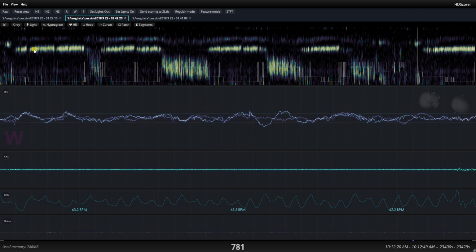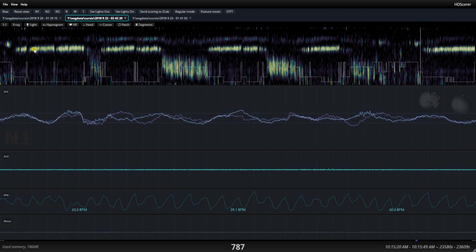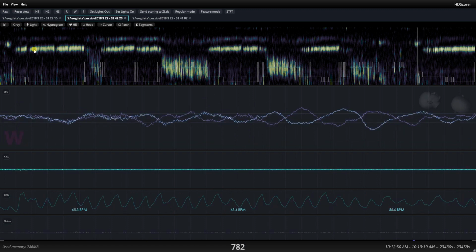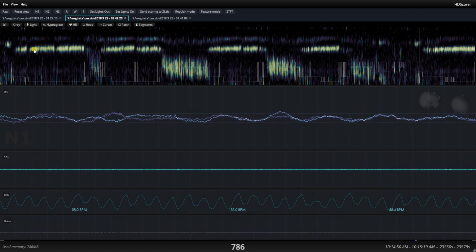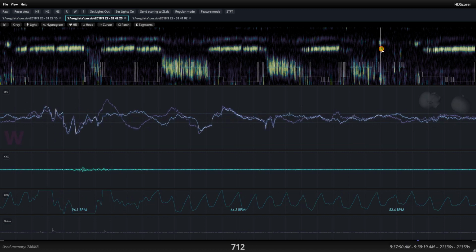So let's say, for example, if I wanted to find fault with this, I would move over here and say, hey, that alpha intensity is continuing, and yet you go down to an N1 sleep. But then the intensity is much decreased. It's decreased quite abruptly. And here I got a bunch of slow eye movements. So I have to say this scoring is really nice. It's looking really good.